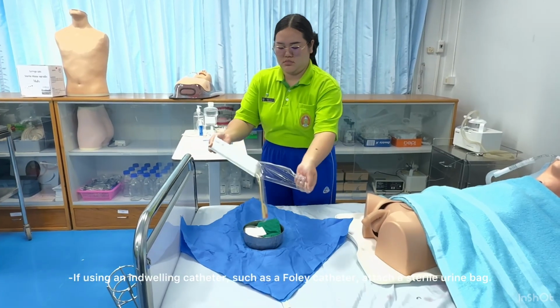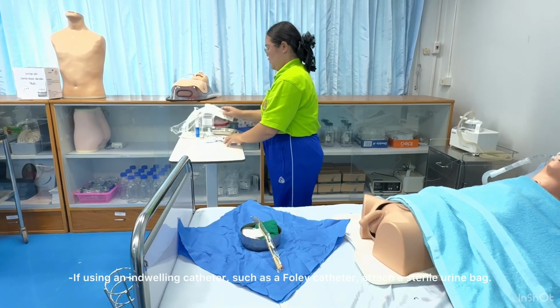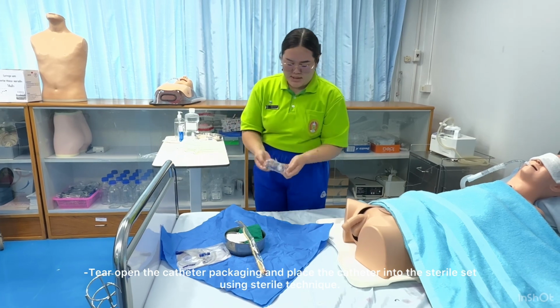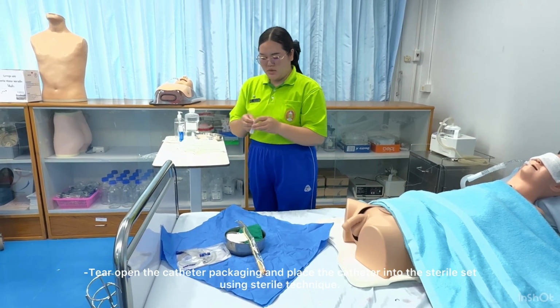If using an indwelling catheter, such as a Foley catheter, attach a sterile urine bag. Tear open the catheter packaging and place the catheter into the sterile set using sterile technique.